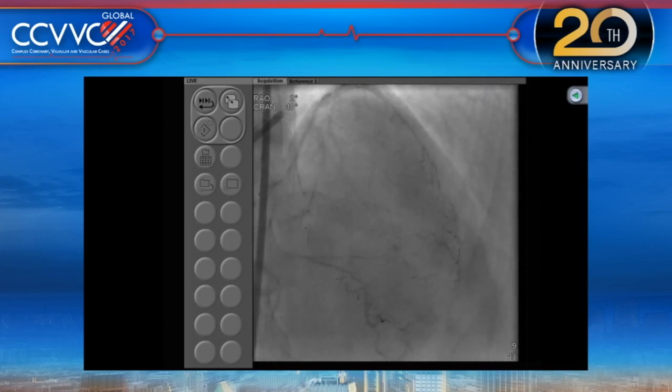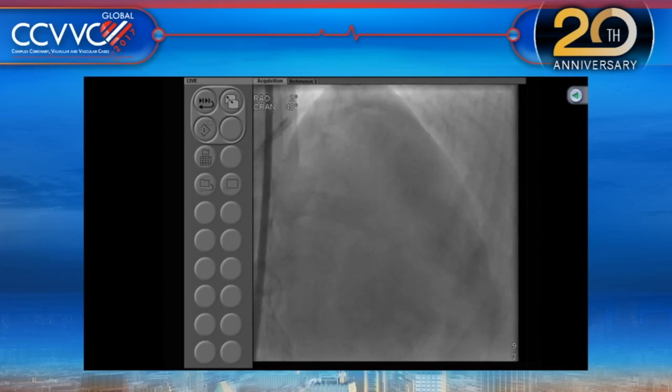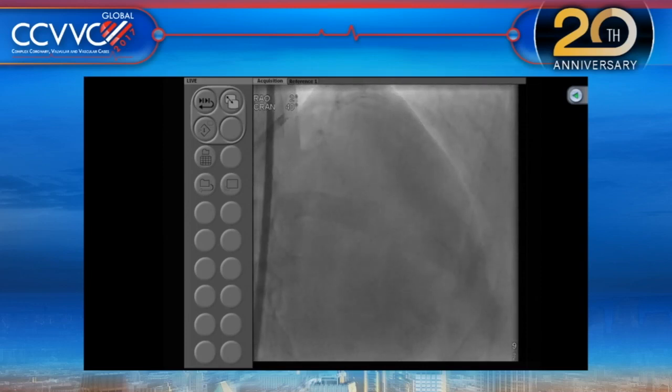While you continue, the reason is that we have a beautiful case, one more case ready. But yes, these are very good points. Whether you use rotational or orbital, I think either one is a dealer's choice in this kind of case. There were a few cases we discussed earlier where orbital versus rotational is preferred. But here, yes, if need be, you can use any.